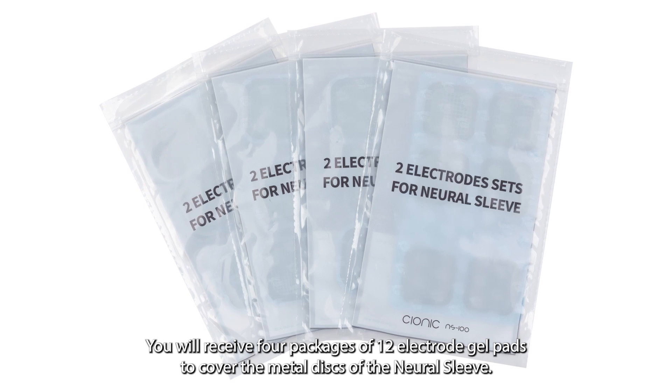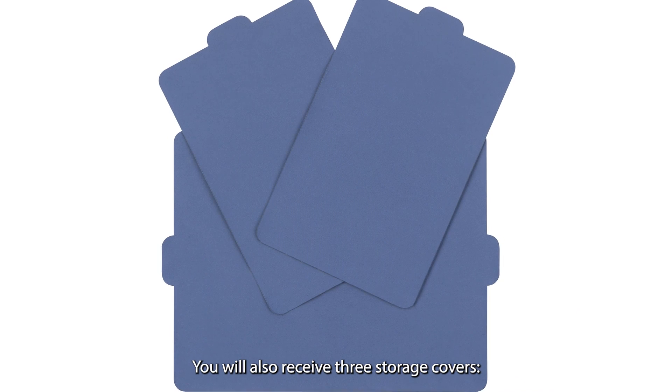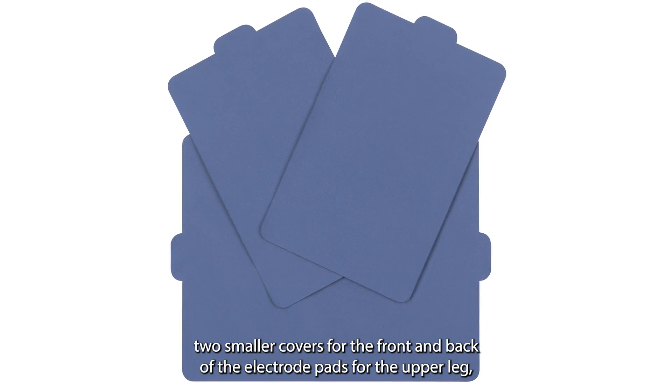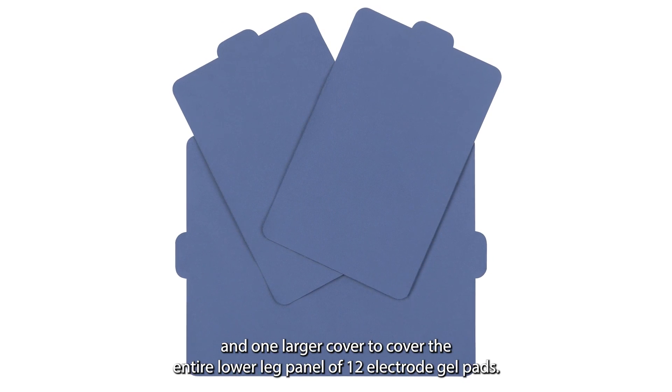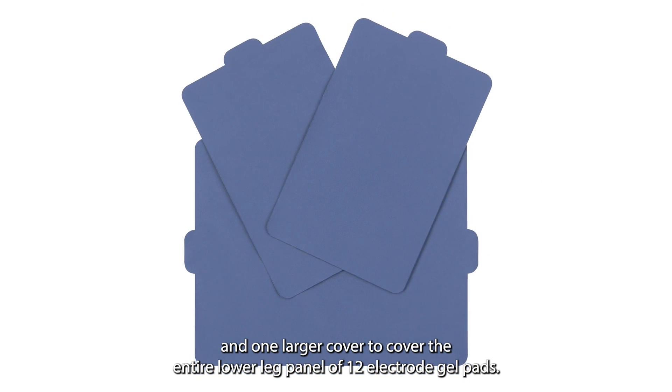You will receive four packages of 12 electrode gel pads to cover the metal discs of the Neural Sleeve. You will also receive three storage covers: two smaller covers for the front and back of the electrode pads for the upper leg, and one larger cover to cover the entire lower leg panel of 12 electrode gel pads.